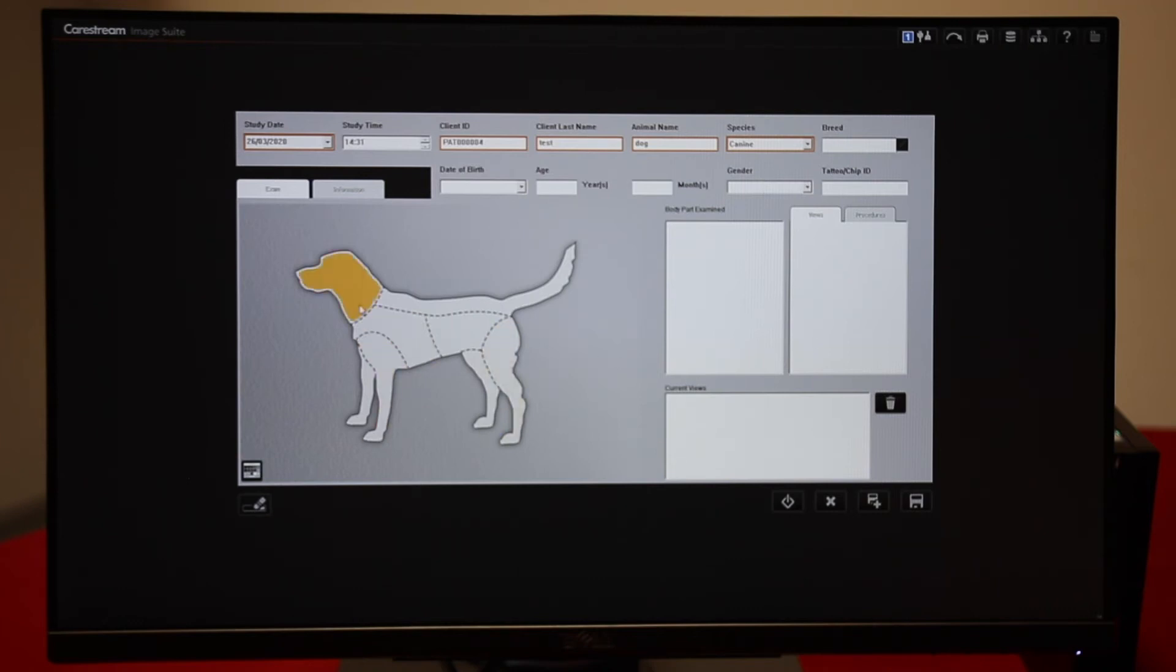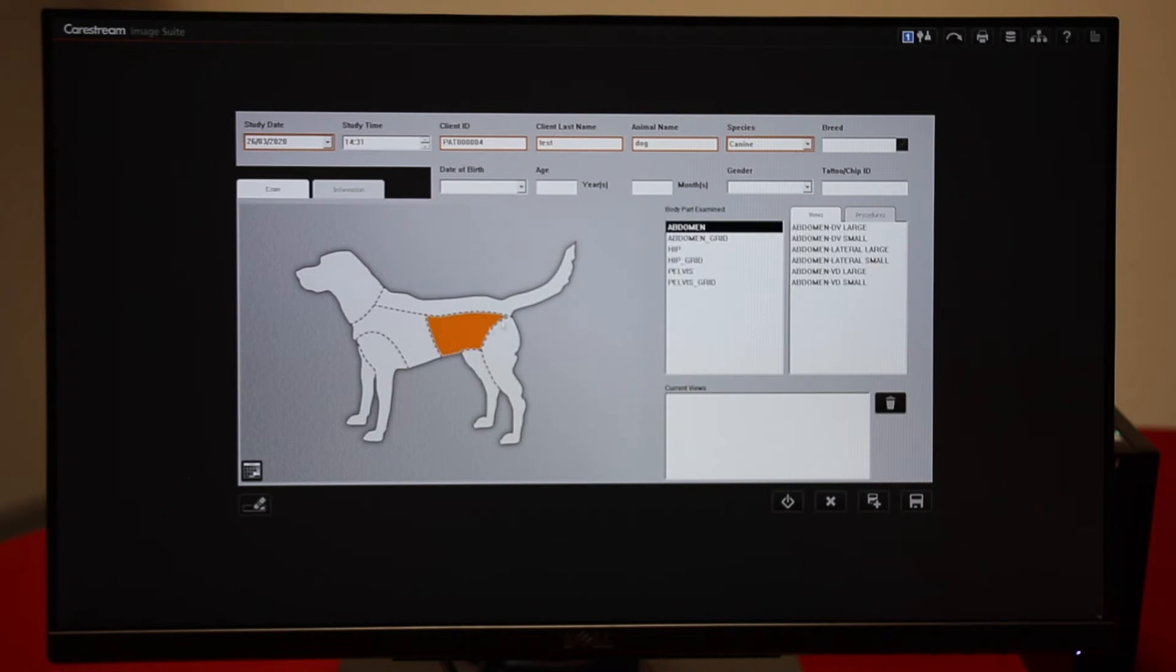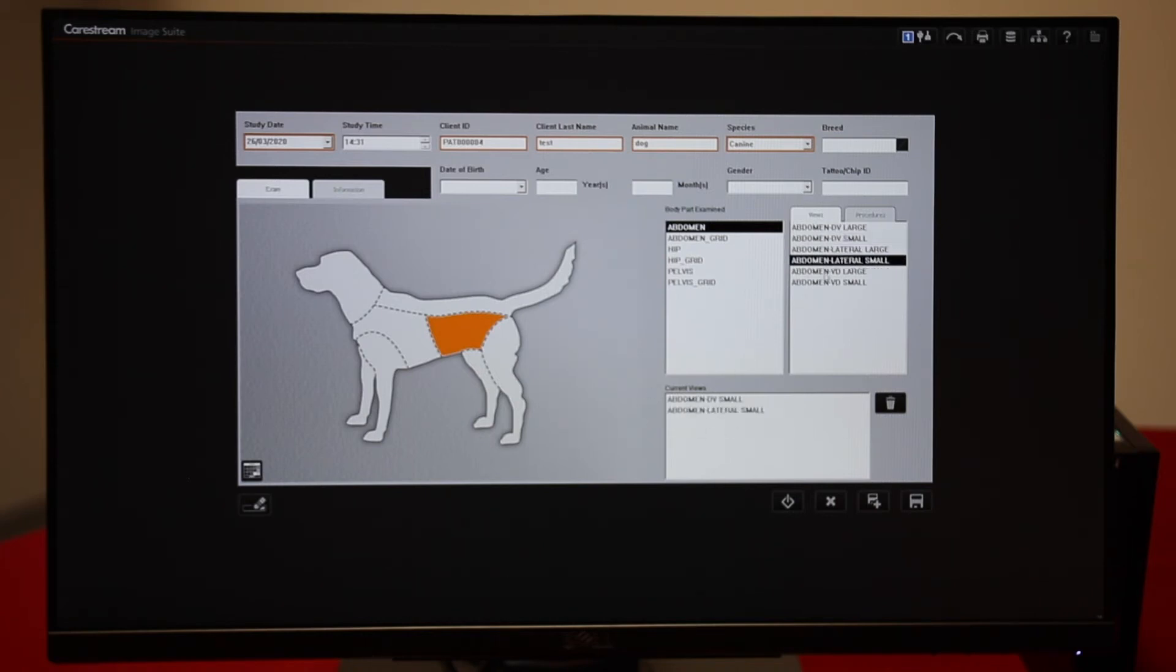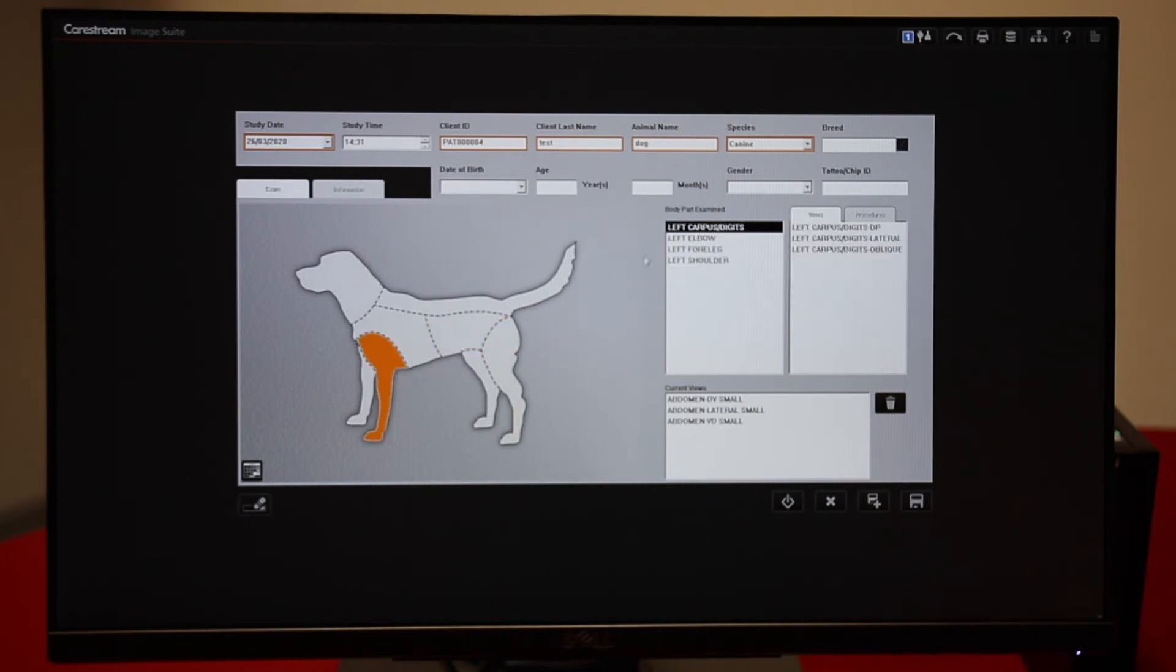Click on the body part to add views. Here are all the possible views and any that you click from here will go into this box here labelled current views. You can pick different areas of the body.